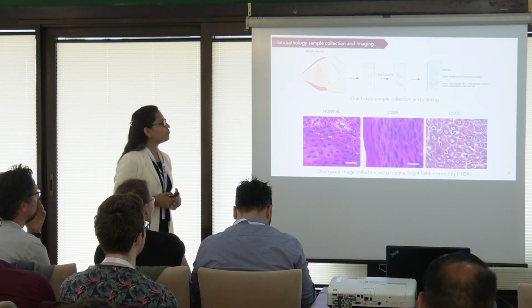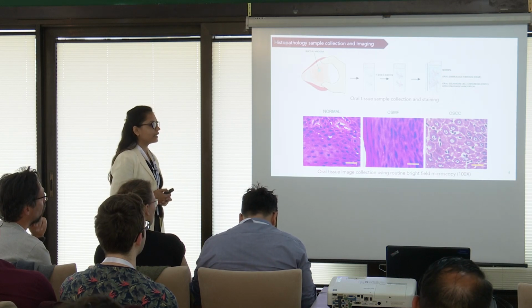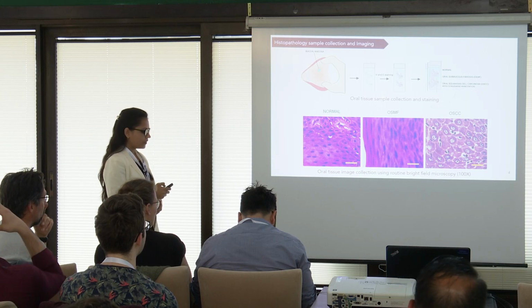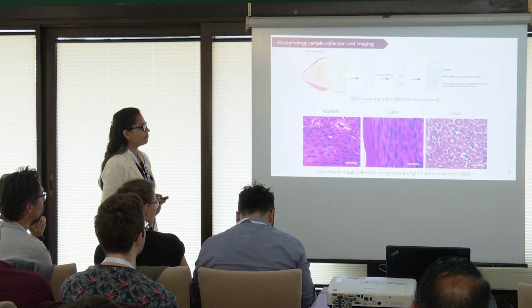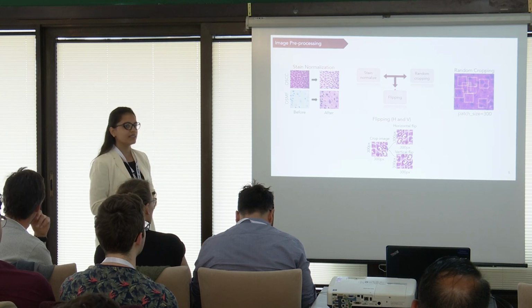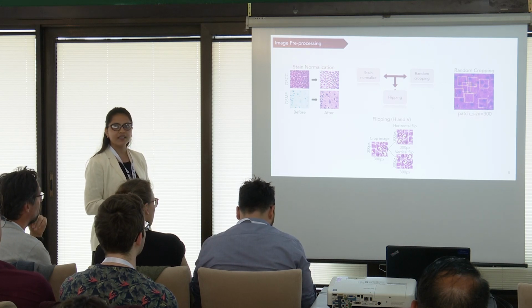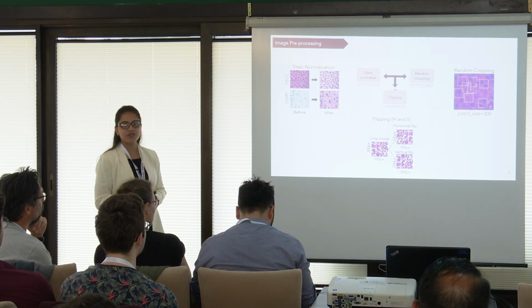After the collection of the samples, they were stained with H&E stain dye, and then the digital images were collected at 100x magnification using routine bright field microscopy. This is a representation of the normal, OSMF and OSCC at 100x magnification. After collecting the images, we proceeded with the image pre-processing steps, which include stain normalization, random cropping in a patch size of 300, and flipping in the horizontal and vertical direction to increase the amount of data given as an input to the machine learning model.